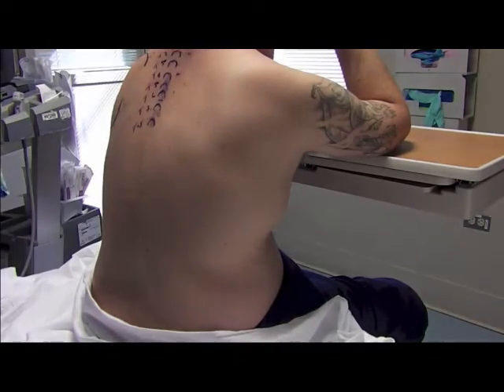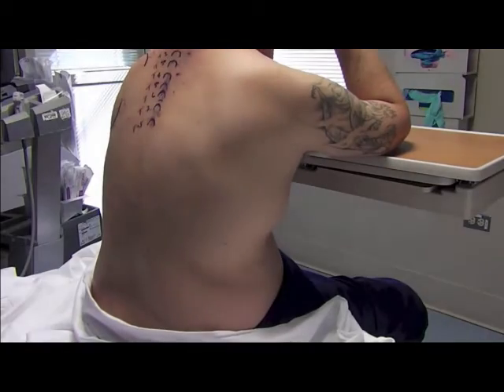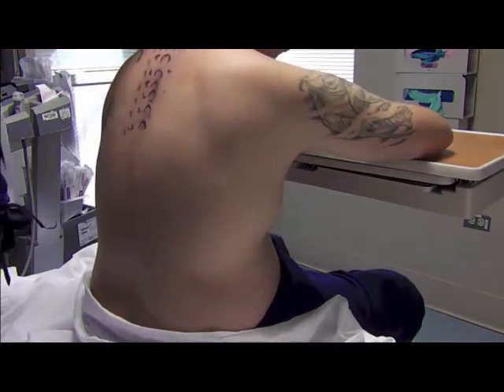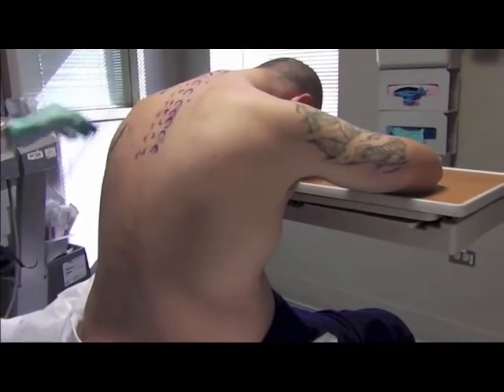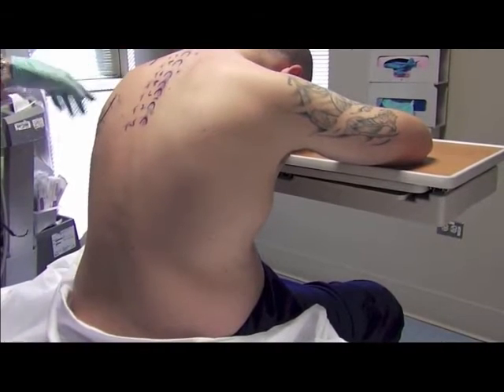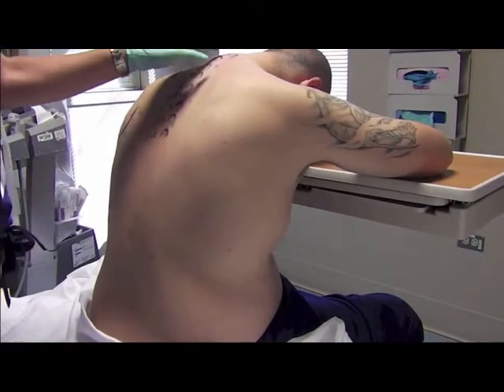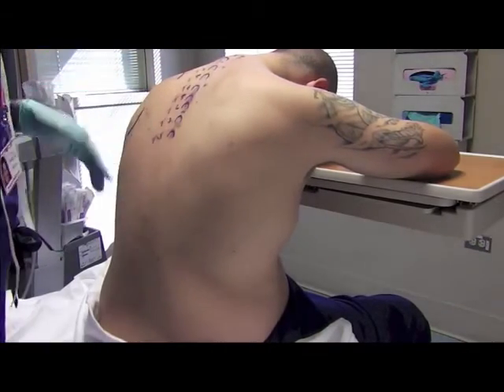At Stanford Hospital we typically position our patients in the sitting position when we place a thoracic paravertebral block or catheter. On this model we have marked out the pertinent landmarks. We have the patient lean over a table just as if we were doing an epidural. We palpate the top of the scapula and the bottom of the scapula. These typically correspond with the T3 level at the top of the scapula and the T7 level at the bottom. The most prominent spinous process is C7, so I usually start there and then palpate my way down marking out each spinous process and the corresponding level.